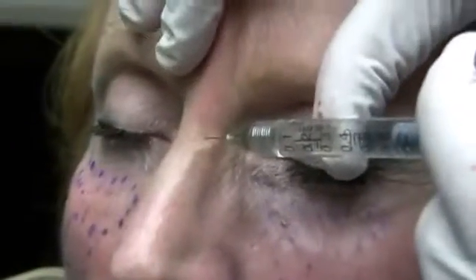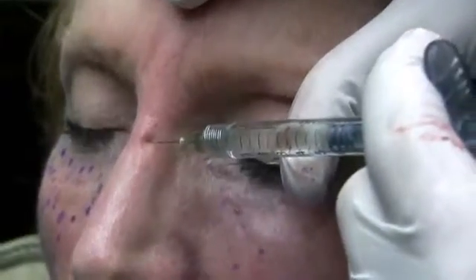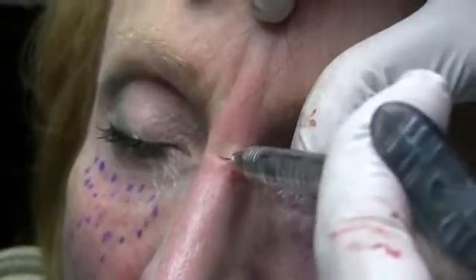And in terms of a little filler rhinoplasty, we're going to put a little dollop of filler over her hump. Yes, her dorsal hump. And you want to put a little bit above it, a little bit in the center, and a little bit below it.